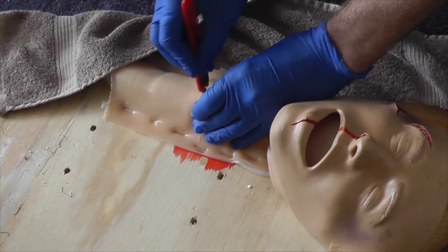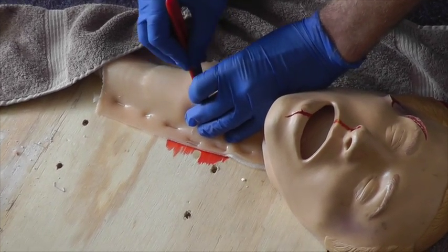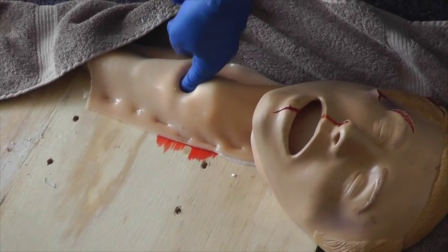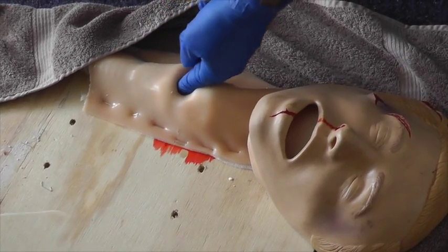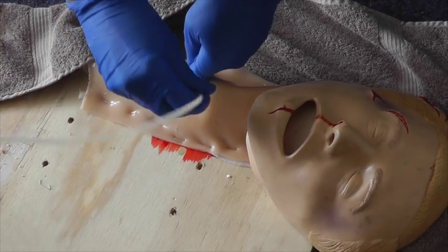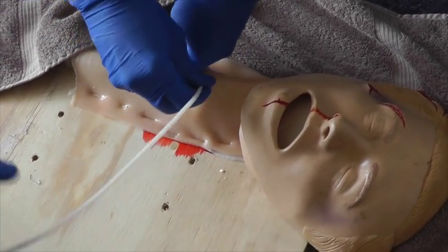I'm going to stab and rock. I'm through — it feels like I'm into the airway. I'm going to check that with my finger, scalpel out of the way. I can feel tracheal rings. Pass the bougie, please. Passing the bougie alongside my finger into the airway.